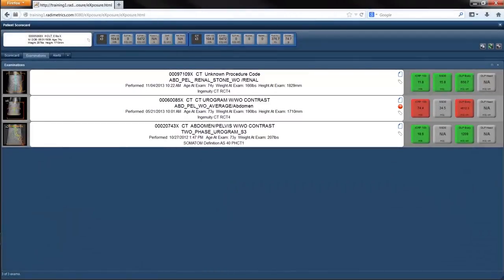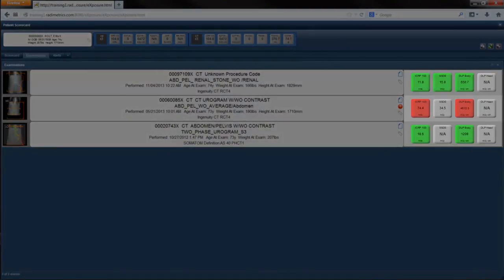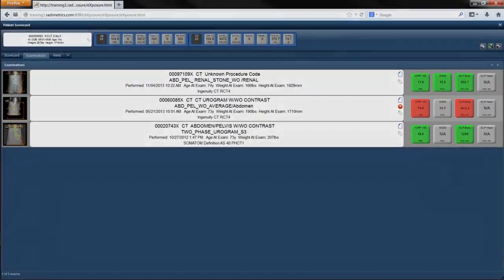On the right are the customized exam level dose tiles. This complete examination history provides insights for referring and ordering physicians about the protocols, modalities, and associated dose within this patient's examination history.